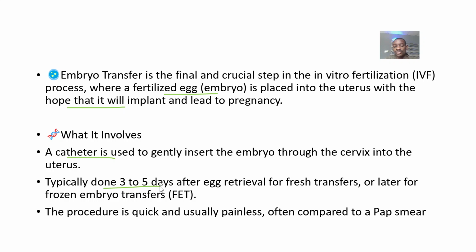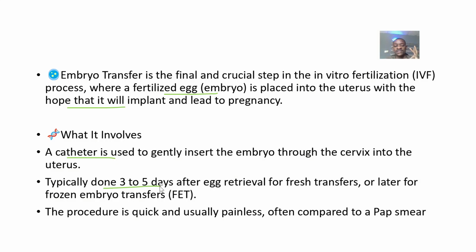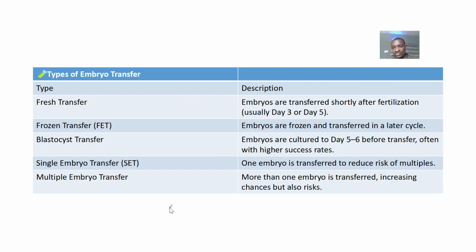Do you understand? So they fertilize the egg outside, they make sure that it starts growing, start dividing before they transfer it. So the procedure is quick and usually painless, often compared to a pap smear. Like the pain, it's painless compared to a pap smear.